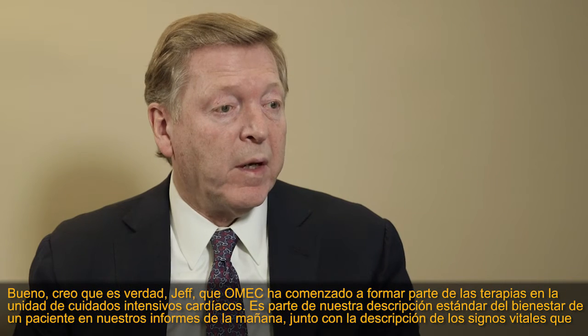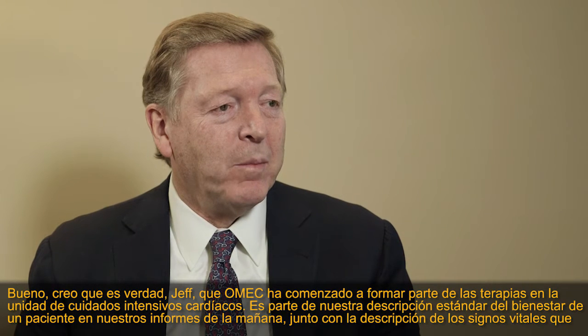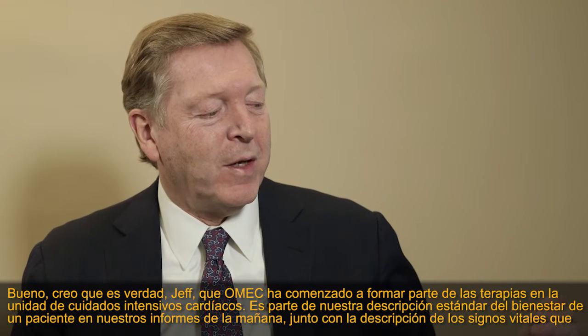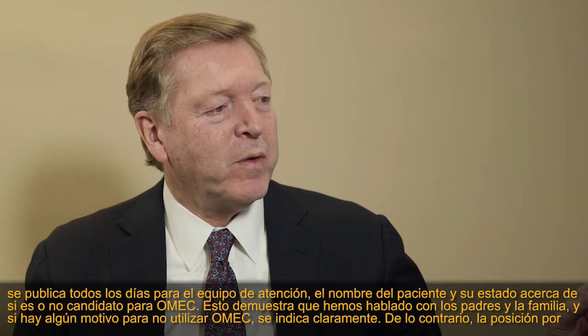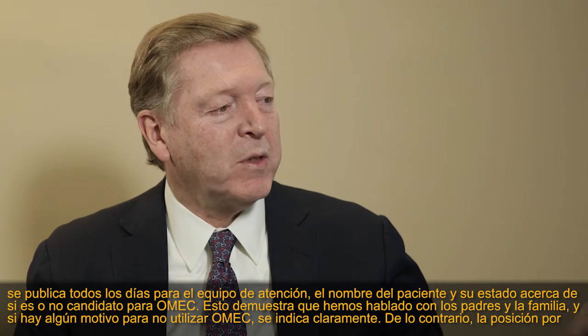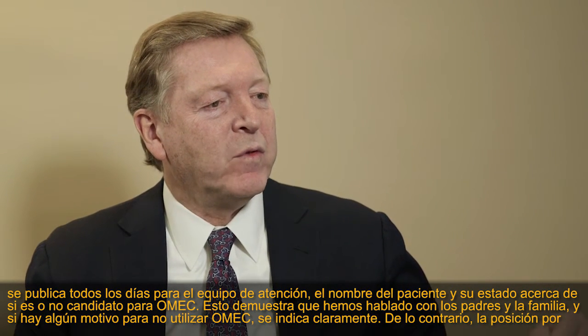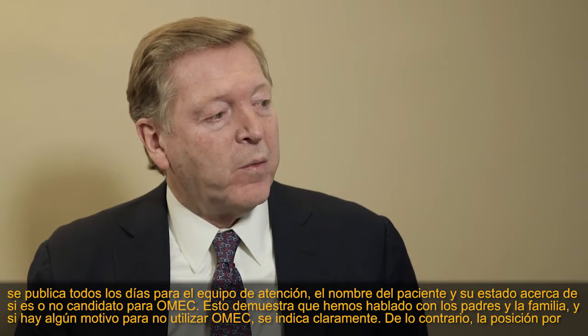Well, I think it's true, Jeff, that ECMO has become part and parcel of therapies in the cardiac intensive care unit. It's part of our standard description of a patient's well-being in our morning reports, along with the vital sign description that's published for the care team, the patient's name, and then his status with respect to whether or not he's an ECMO candidate is published every day. And it just goes to the point that we've had the discussion with the parents and the family. And if there's any reason not to utilize ECMO, then that's clearly stated. But the default position otherwise is that if the patient has an unexpected cardiac arrest, ECMO is part of the routine, the A, B, C, Ds, and Es of resuscitation.